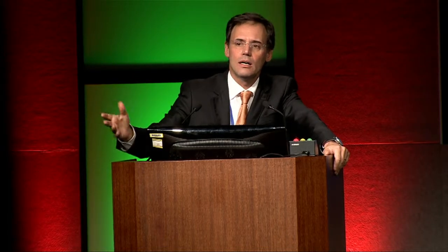So it's a composite of many findings. The left ventricle is dysfunctional and very dilated. You see left to right shunt across the PFO. You see retrograde aortic arch flow. There's no antegrade flow across the aortic valve, and you see a monophasic pattern when you put your Doppler across the mitral valve. So when you come across a patient with critical AS and all these findings, over 90% of the time these patients develop hypoplastic left heart syndrome. And this is why we indicate the procedure, to halt this progression and try to achieve a biventricular repair, which is our goal. A reasonable biventricular repair is better than a good univentricular repair, at least in our hands.